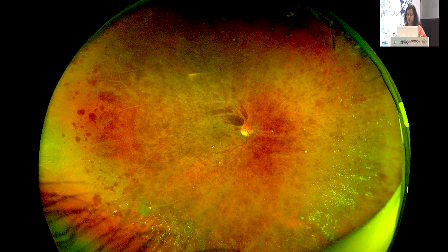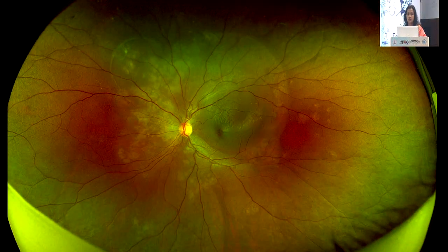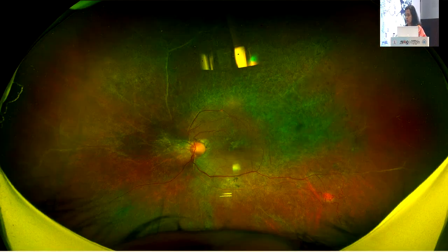This is again a patient with CRVO. You can show the entire extent of the disease. Patient thinks there are just 1 or 2 hemorrhagic spots. What's the big deal? But here's a tool where you can use it. This is hypertensive choroidopathy, very rarely seen, but we could well document it because it was well beyond the posterior pole itself.